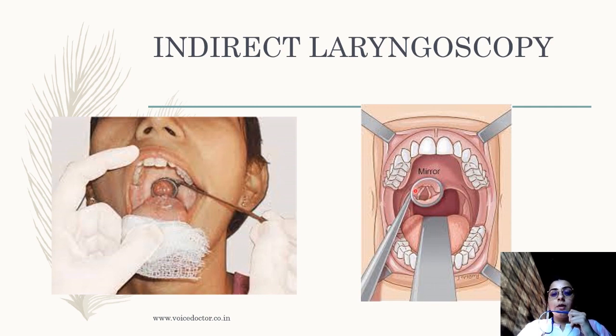When you insert the mirror, this is the image you will be able to collect on the mirror. If the procedure is performed comfortably, you will get a good view on the mirror, a view of the voice box, and the patient will say E. When the patient says E, the vocal folds will come close to each other, and when he breathes, it will open up. So you will be able to visualize the open and close movements of the voice box.